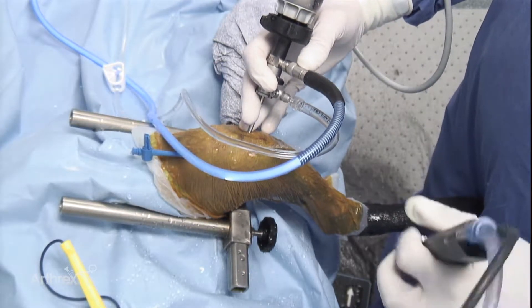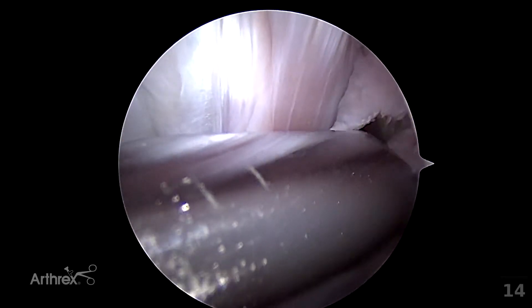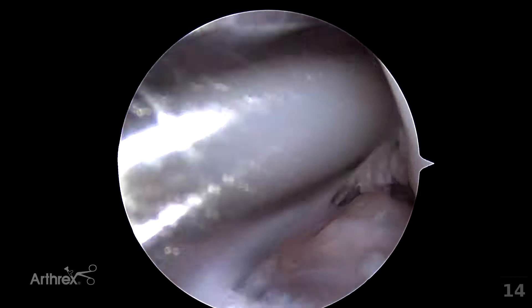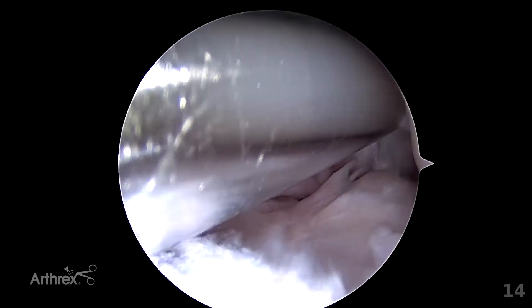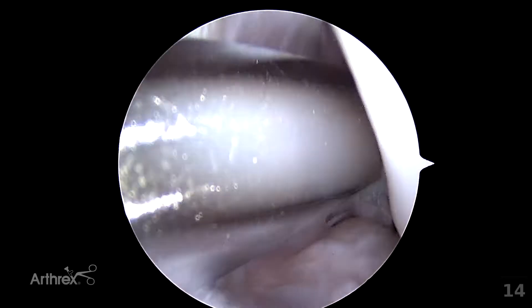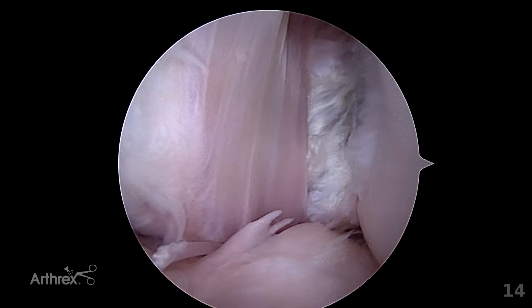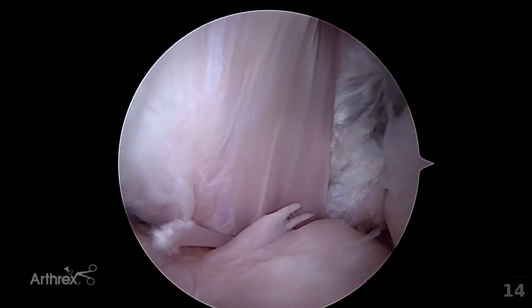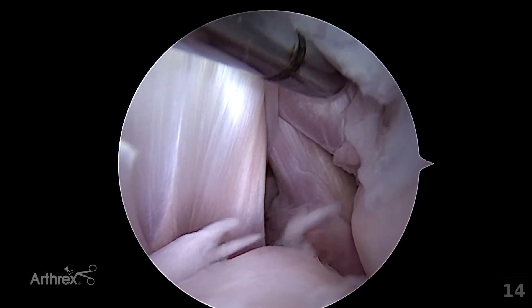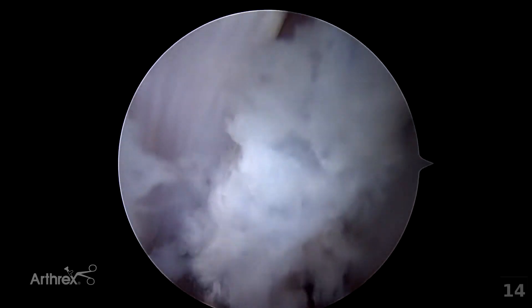The scope may be placed deeper into the joint and the post turned to look back into the notch. Use of the 30 degree offset is beneficial when maneuvering around the joint and assessing intra-articular structures completely. It is not crucial to remove the remnant of the cranial cruciate origin completely, but rather to clean the notch so that placement of a distraction lever is possible. It is important to identify the lateral meniscal ligament as it moves towards the femur — this will be sitting in the notch in the ventral aspect below the cranial cruciate ligament. By retracting the cranial cruciate ligament, we can visualize that ligament as it attaches to the lateral meniscus and runs in the caudal aspect of the joint, caudal to the caudal cruciate ligament.